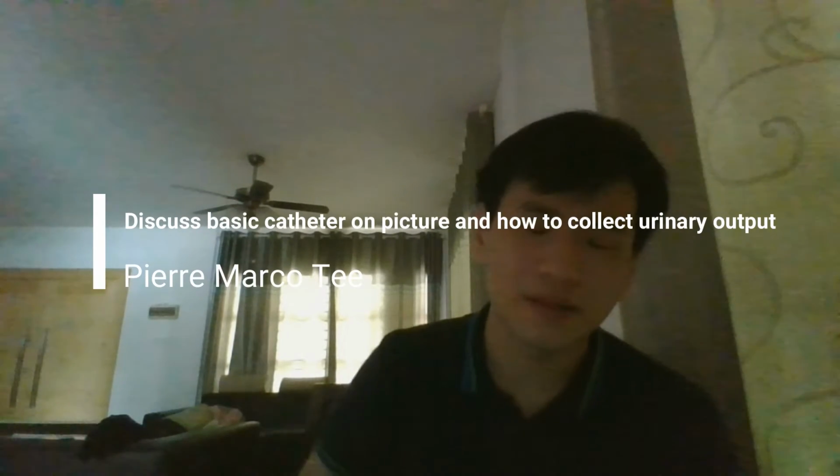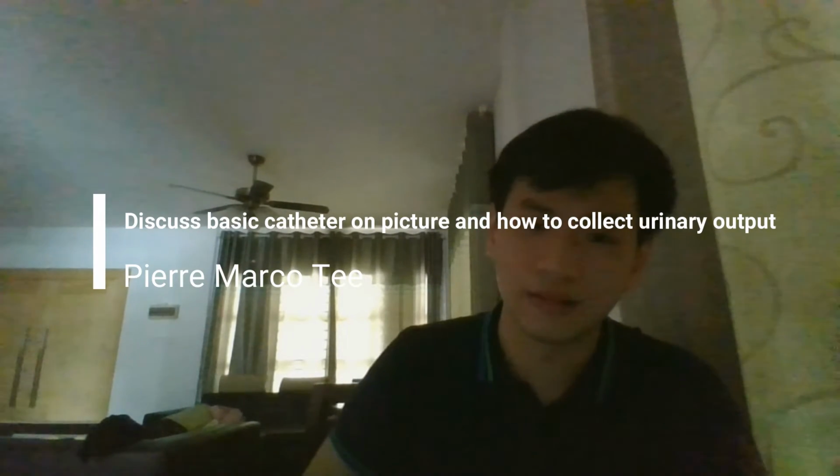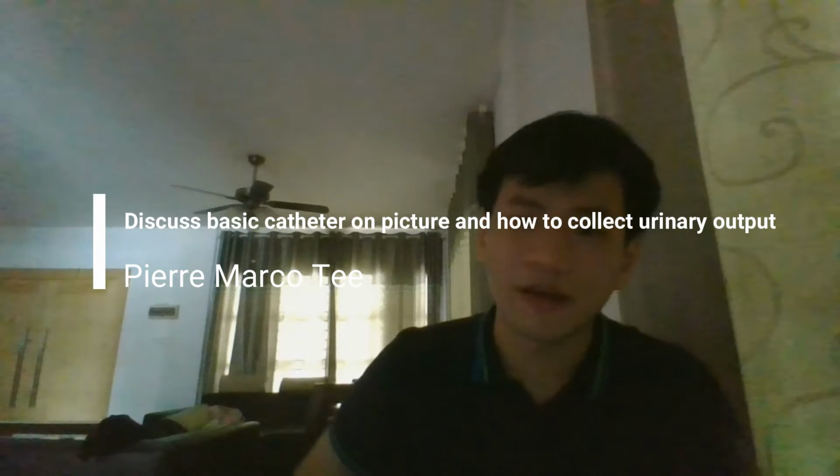Today I'm going to discuss the basic catheter, and I'm going to have pictures like right here. So anyway, first of all, a basic catheter is basically a thin tube often made of soft plastic materials, which is inserted into the body. The function of a basic catheter is of course to drain the urinary bladder when it cannot be emptied normally. This process is known as catheterization.